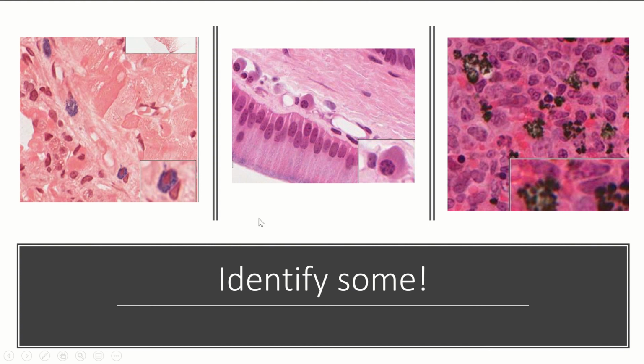So now we're going to practice identifying some. So this one right here, right? Remember we said this bright red nucleus with blue cytoplasm is different than most cells. So it really sticks out here. This is going to be a mast cell. Right, a mast cell, and remember we said those are there for inflammation to call everybody else to the scene, right? So you can see there's quite a few here. You don't normally see 3 mast cells so close to each other, so that tells me that there's inflammation going on in here. That tells me that something's going on, that these mast cells are trying to bring attention to.